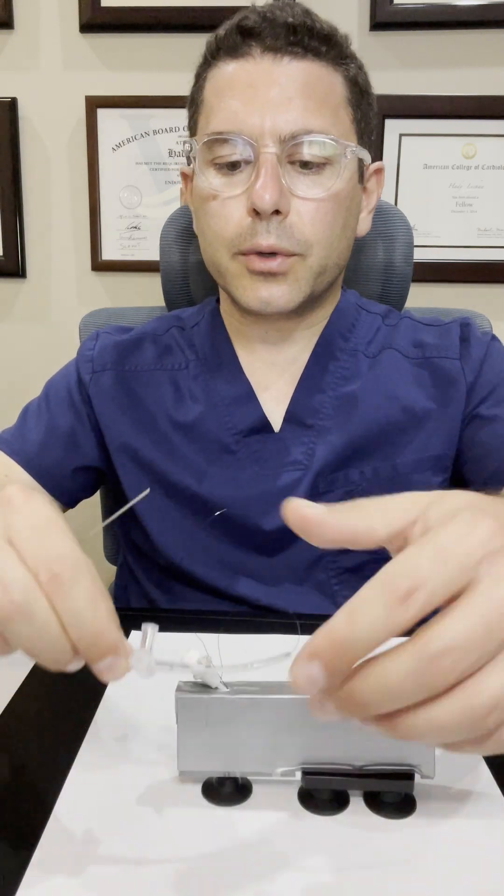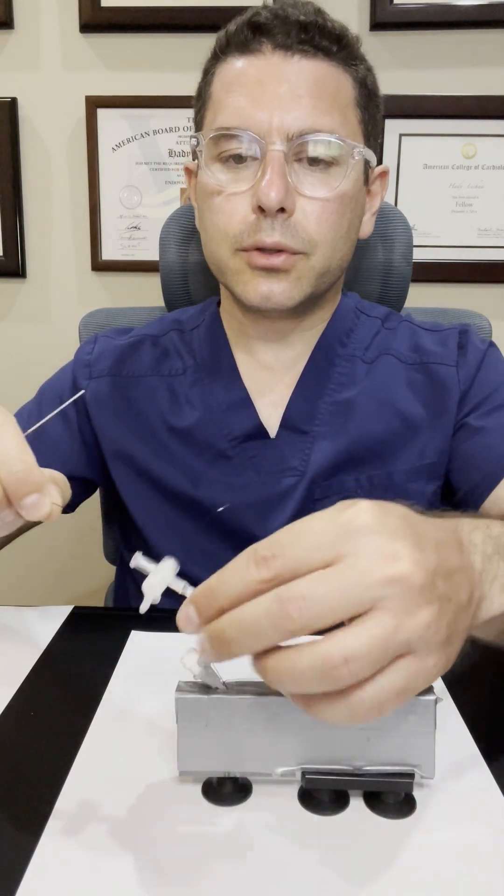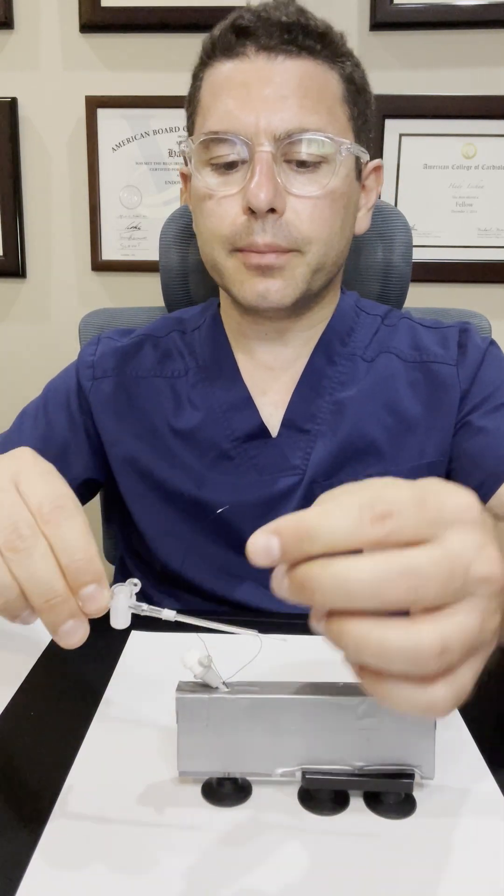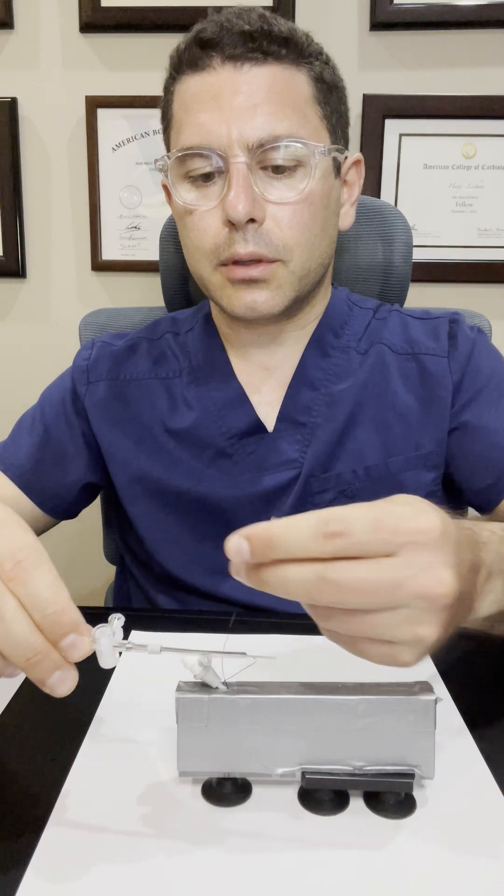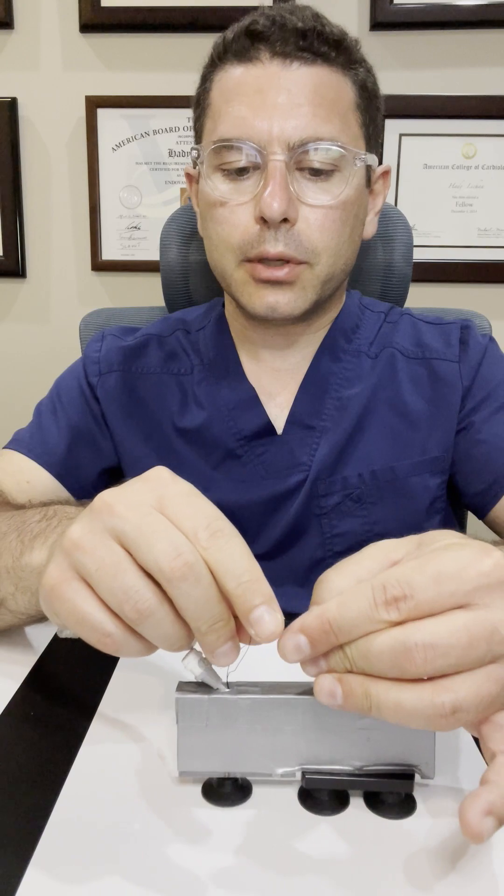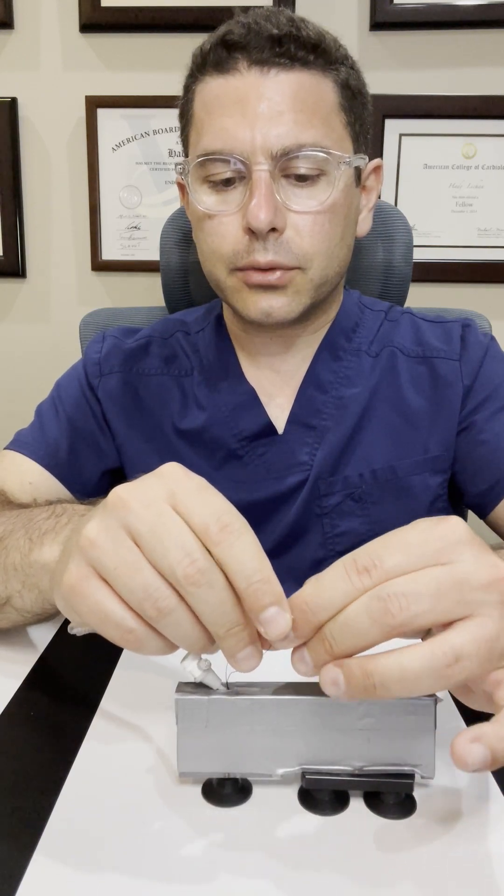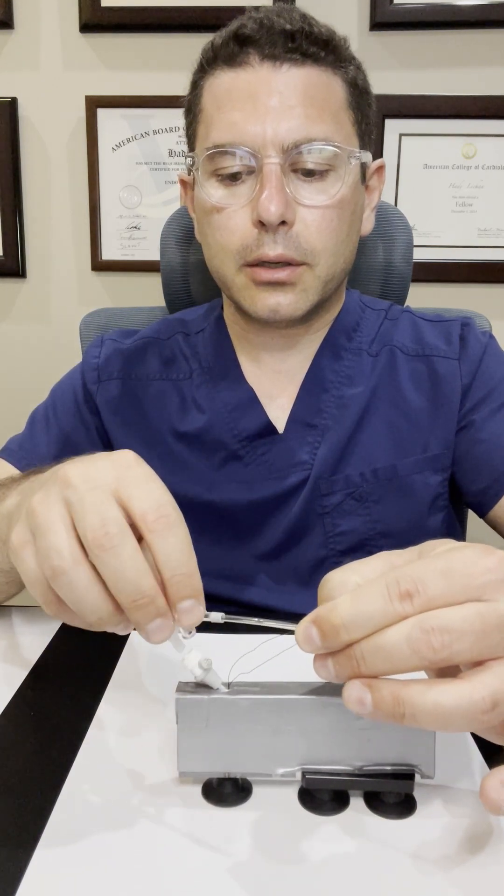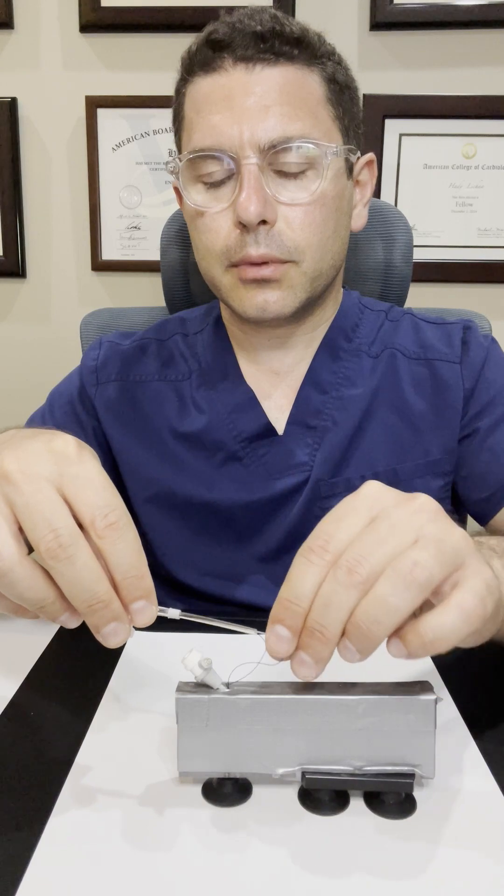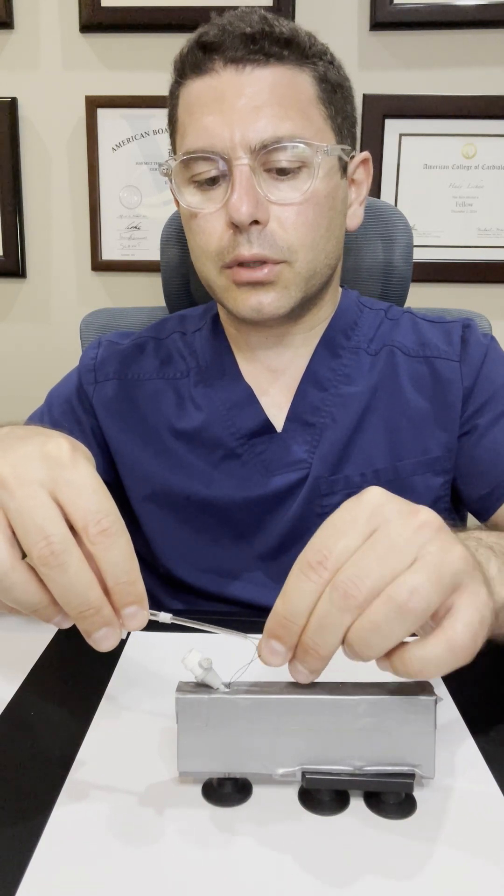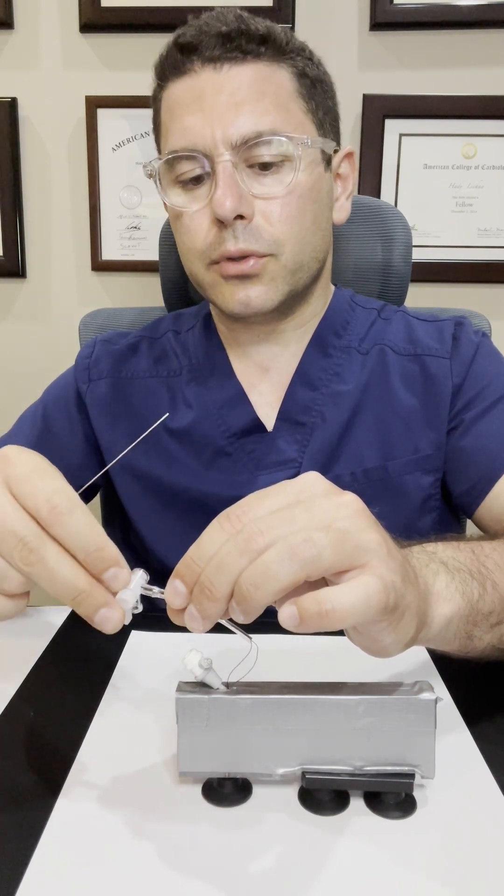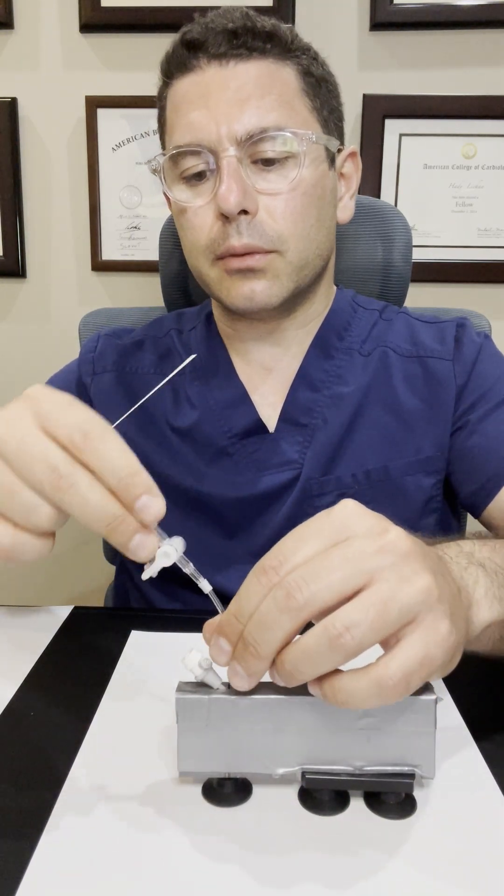Same thing. Now we're going to do the same thing with the locking suture. We'll introduce the introducer through the sheath side port, and then we're going to take the tip of the locking suture carefully without pulling too much on it in order to make sure we don't lock the knot. We advance it a couple of centimeters in, and usually the introducer can pull it through. Most of the time it barely reaches the side port.